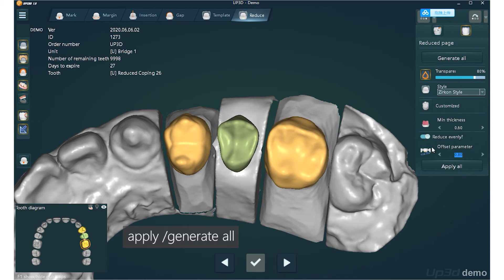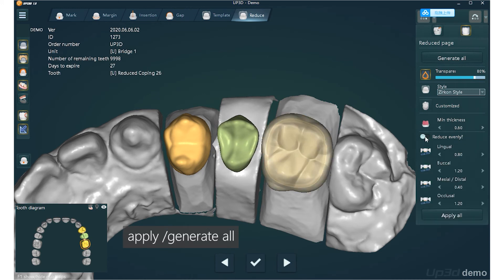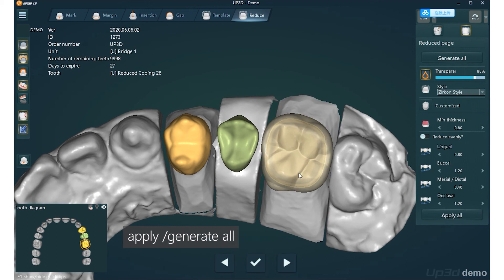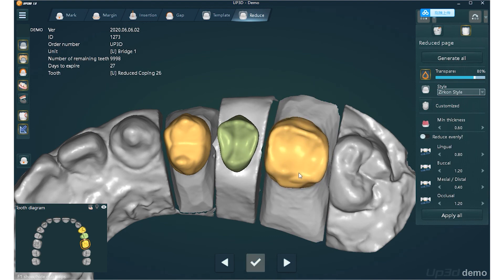If you only want to generate the current crown, click the apply button. If you want to generate all crowns, click the apply all button.